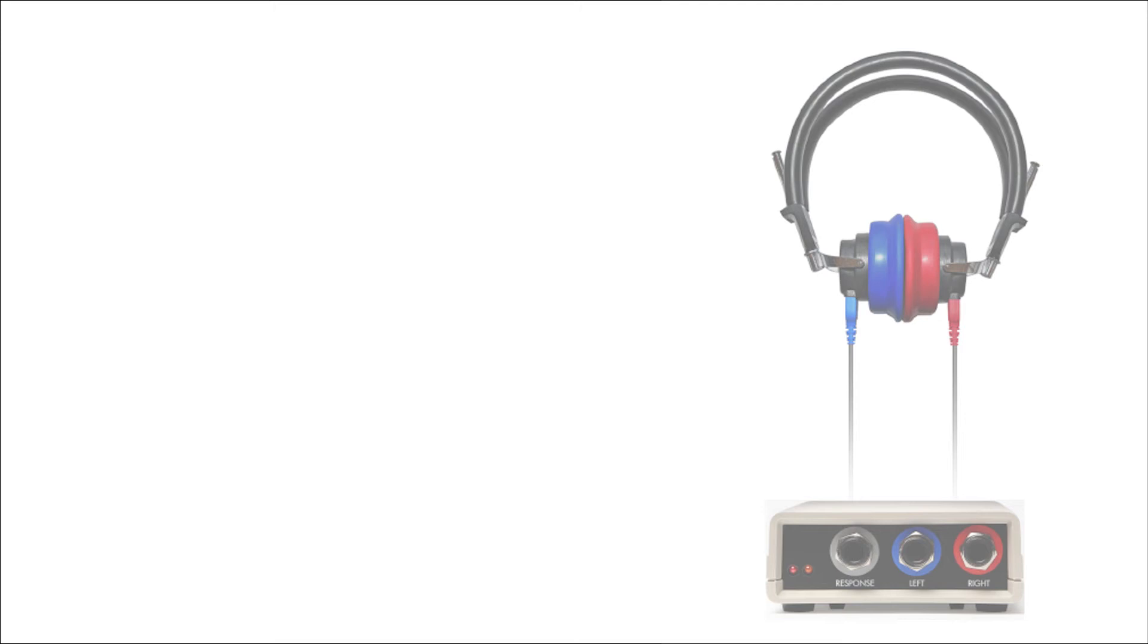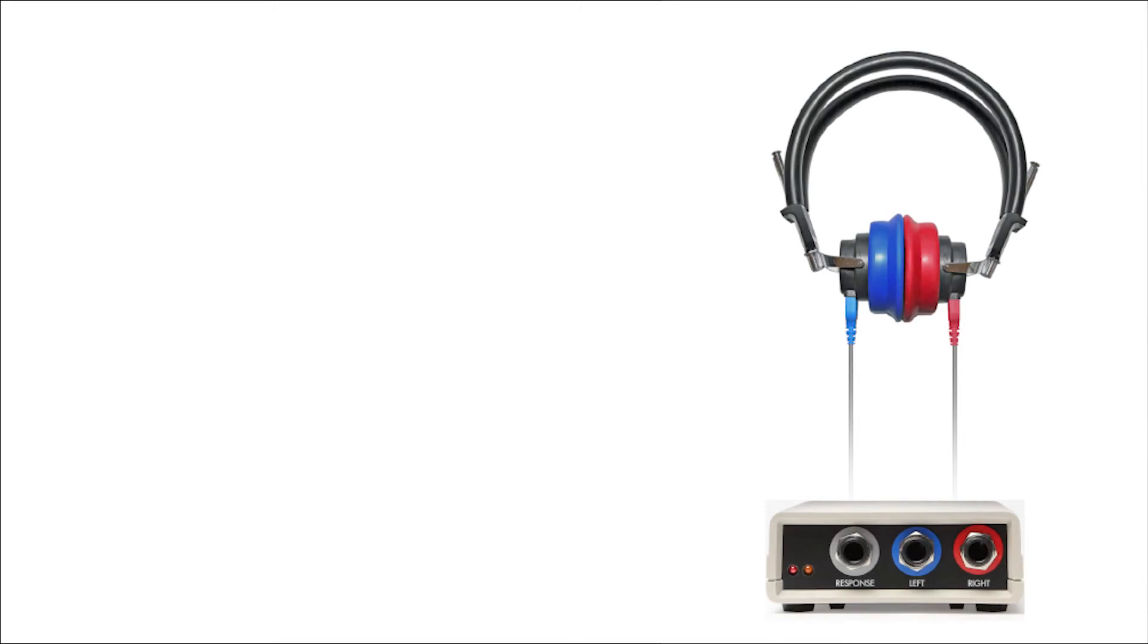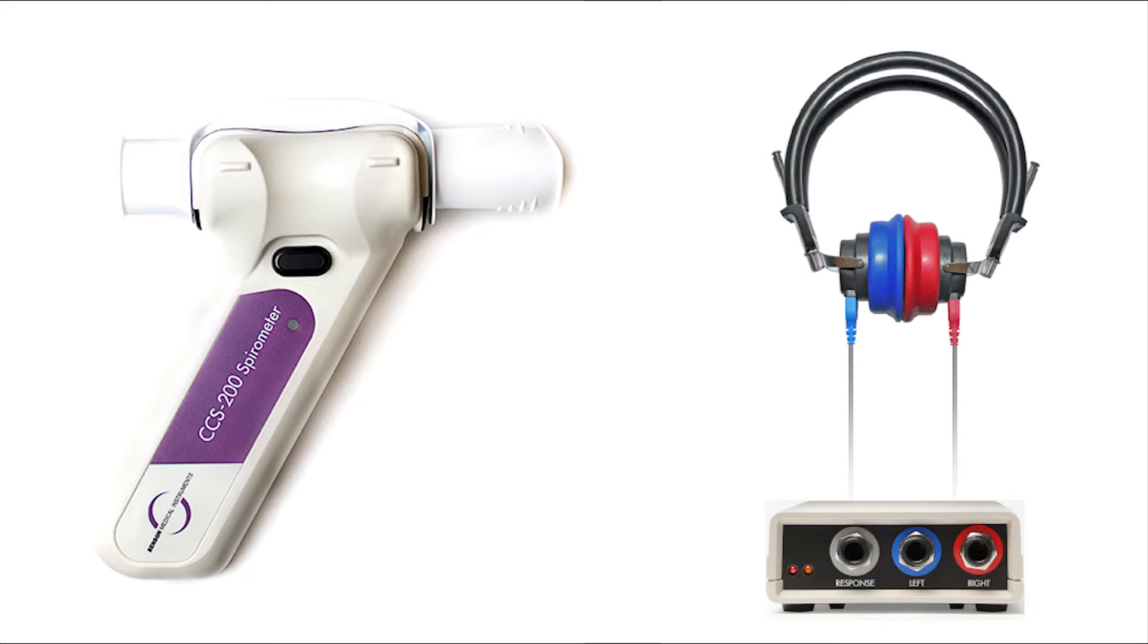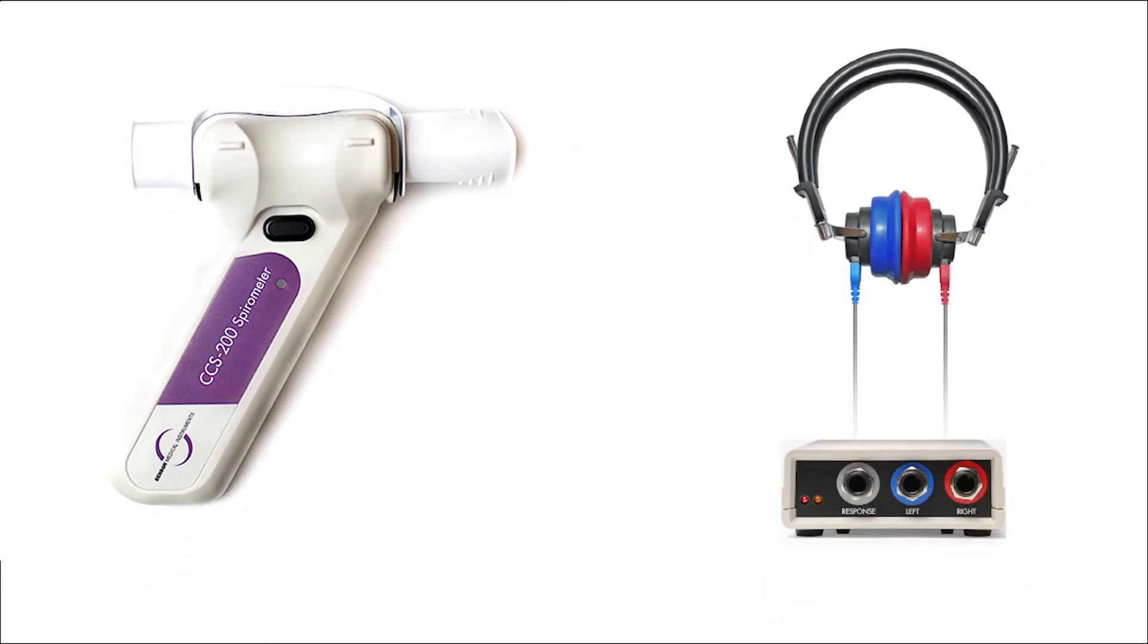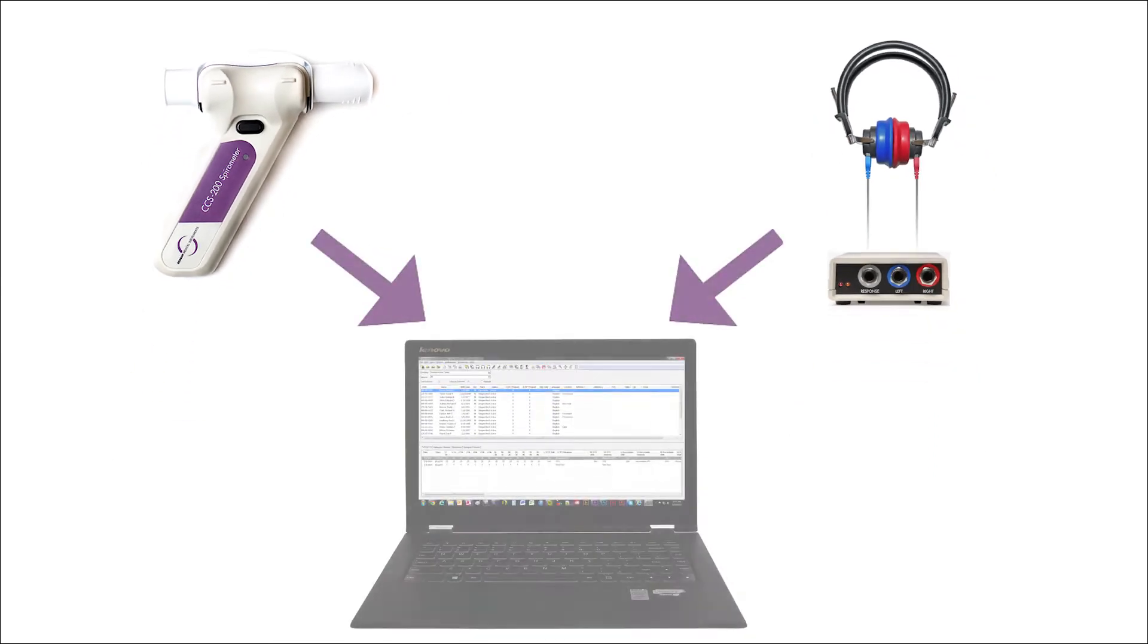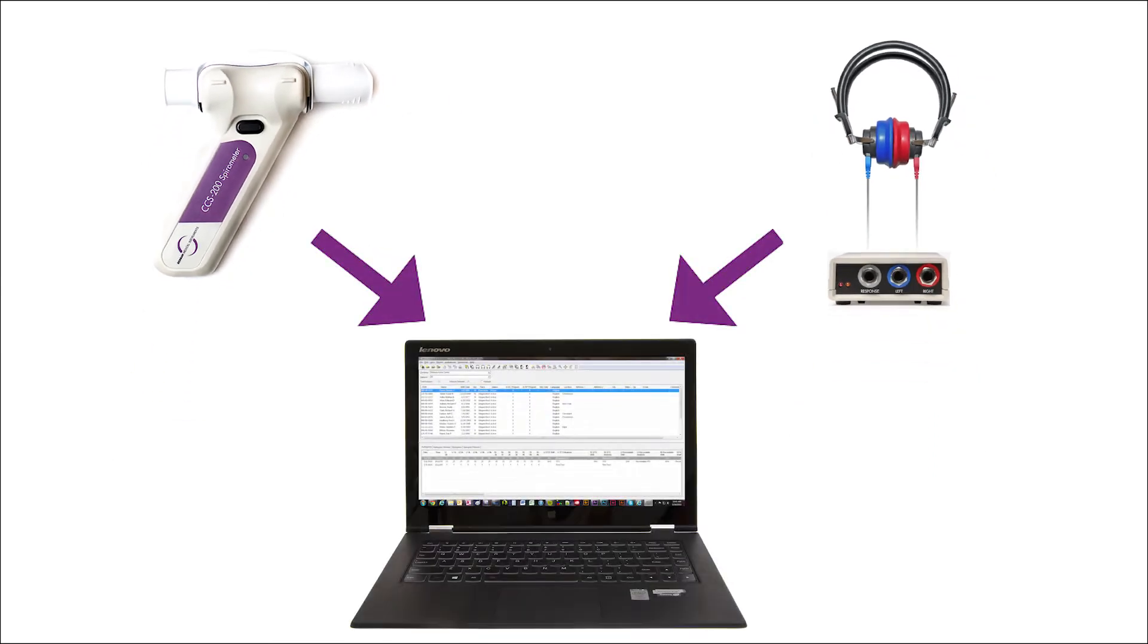When you buy both the CCA200 Mini Plus audiometer and the CCS200 Plus spirometer, you get not only the most powerful occupational instruments available, but also the advantage of sharing a single database for both audiograms and spirograms.